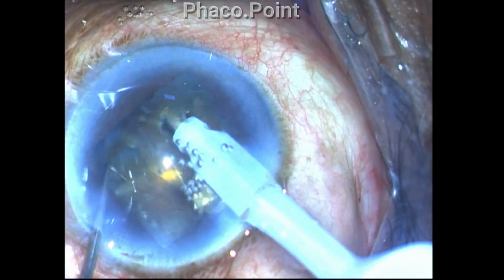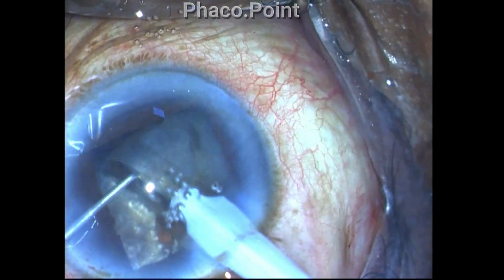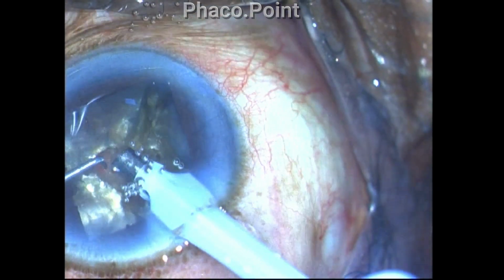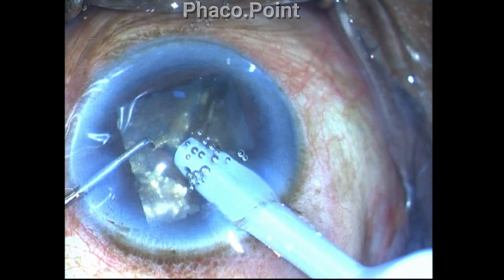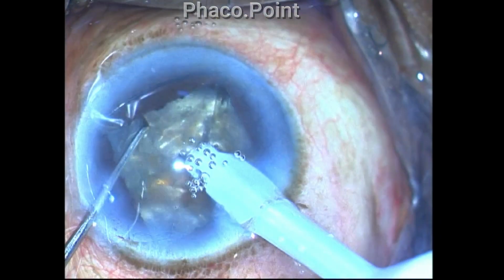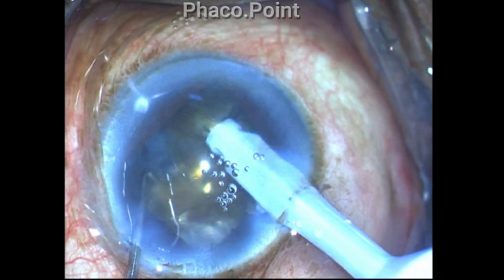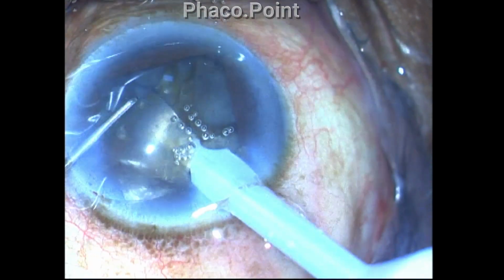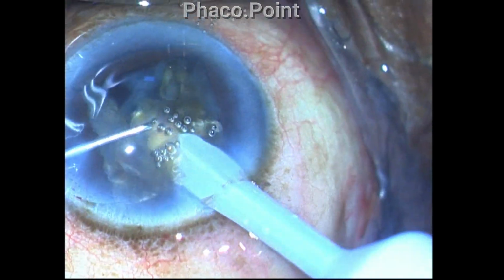And I'm always watching out for the appearance or the reappearance of the Descemet membrane detachment, to see that abnormal membrane fluttering around in the anterior chamber. And thankfully that is not happening, and I am able to impale the nucleus and then continue with phacoemulsification. I have created the 4 fragments by this point.